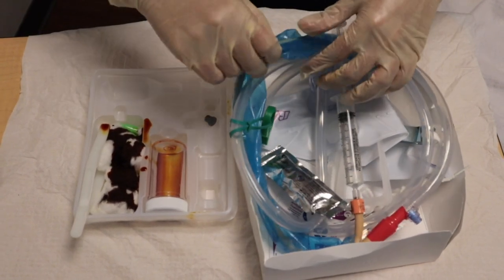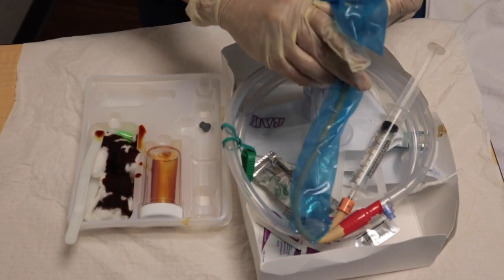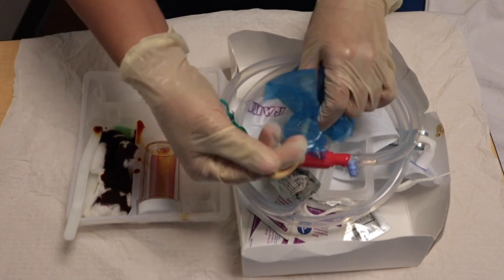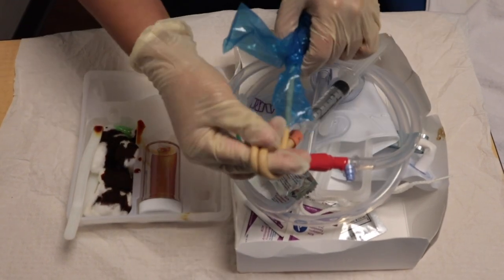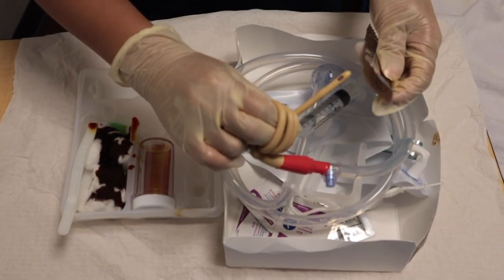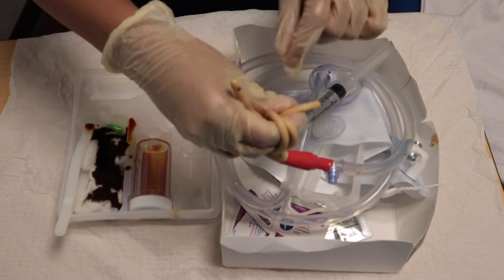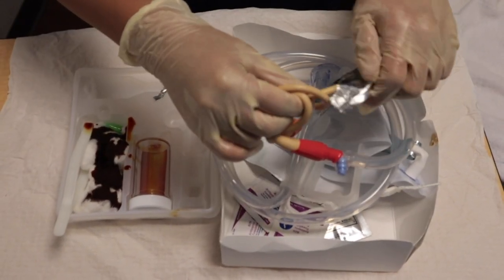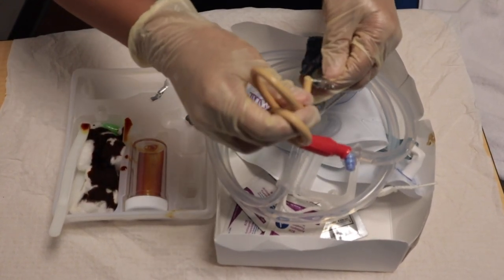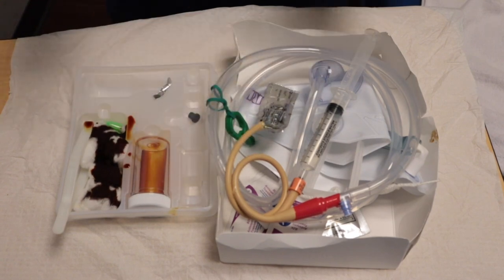Put it back inside. Then, grab the rubber part of the catheter, which usually has a sterile blue plastic covering on it. I like to wrap the rubber catheter around my fingers as I slowly and carefully remove the plastic covering. This ensures the catheter doesn't fling around accidentally while removing the covering, which can break my sterile technique. Pick up the open lube packaging and insert the catheter inside. This is just preference. You can squirt it onto the tray and dip the catheter in the lube. Through trial and error, I noticed that can get messy and slippery for me. Once lubed up, you can put it back inside.